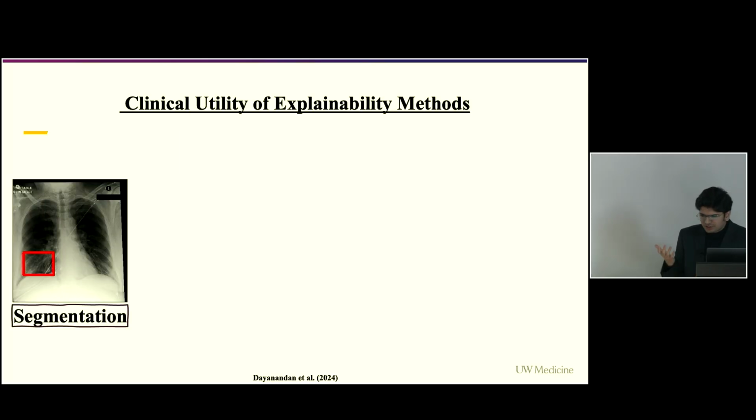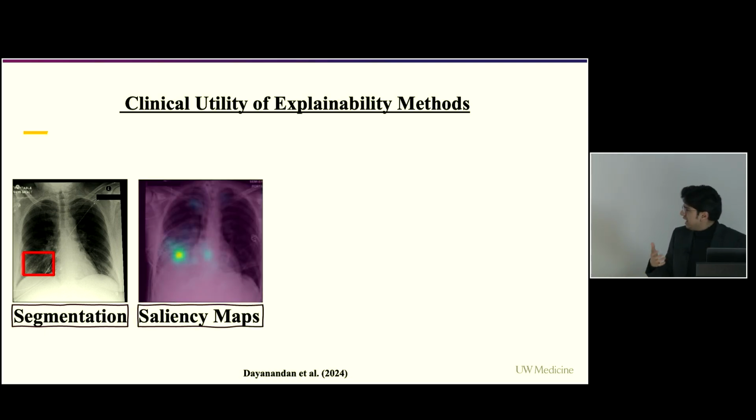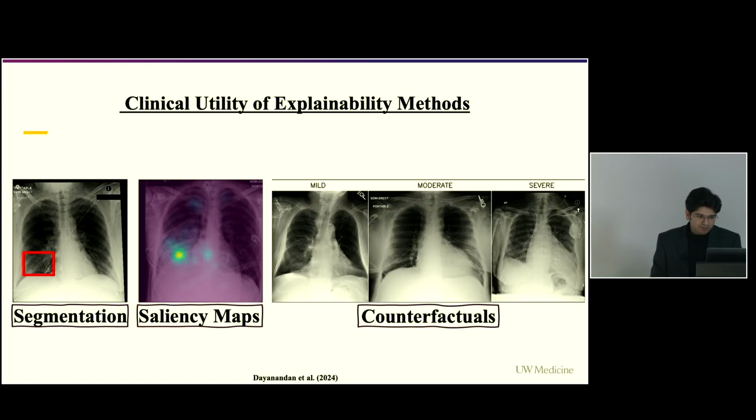So we saw a whirlwind of techniques to see what type of mechanisms or visualizations we may use to explain the latent decision-making process of these amazing deep learning models. Like we could have a segmentation. We could have these saliency maps that can try to pinpoint where the model was looking, or we can have these counterfactuals that can help us understand what changes in the model drove a change in the model's predictions.